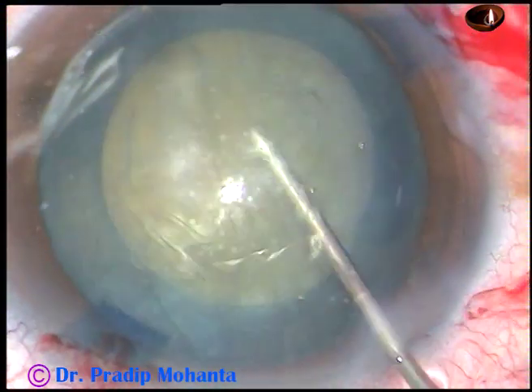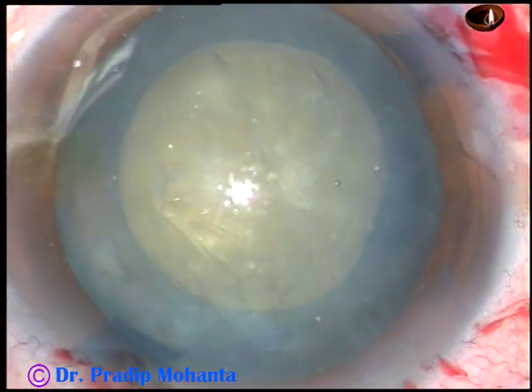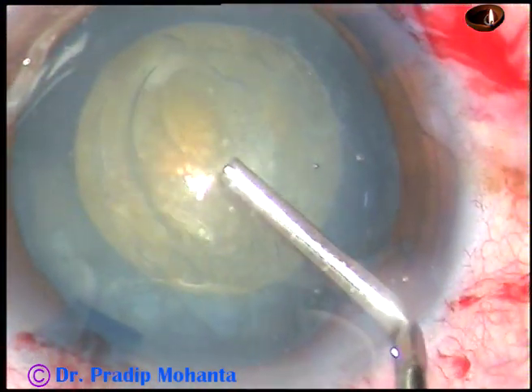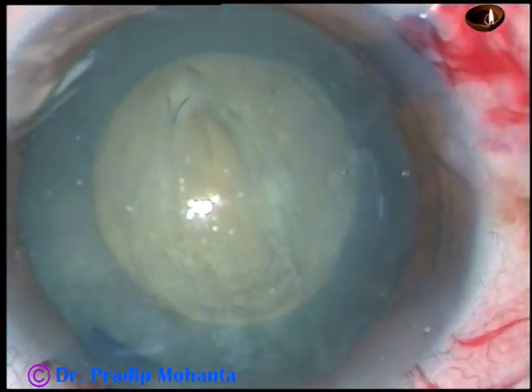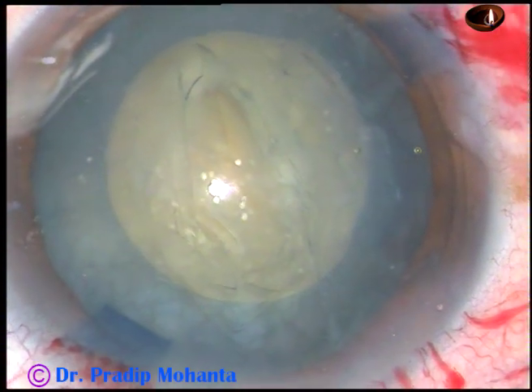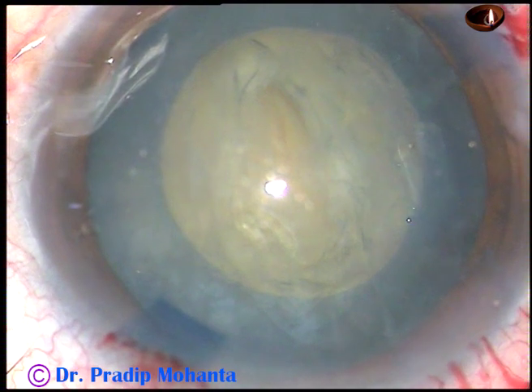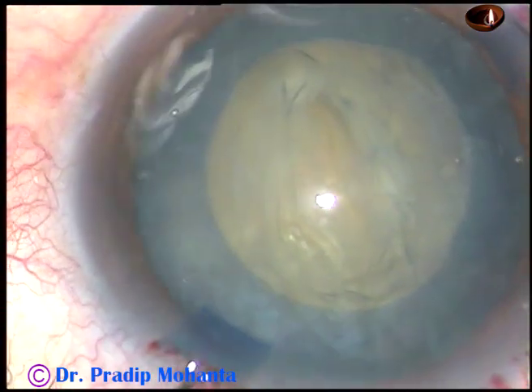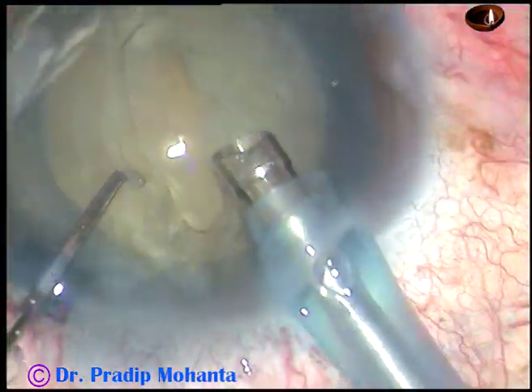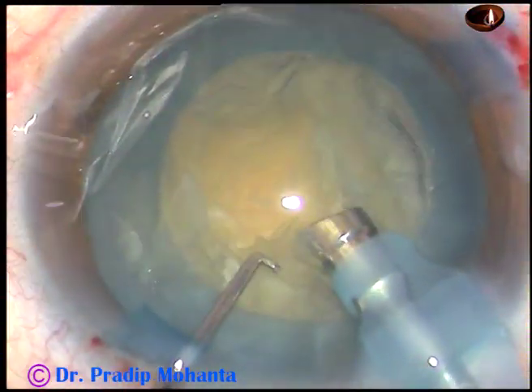Now hydrodissection is done and the nucleus is rotated. Visco is injected again and now is the time to introduce the tip of the phaco handpiece. The machine being used is Oertli Catarix 3 from Switzerland. The tip of the phaco needle is introduced into the anterior chamber with bevel up, keeping the bevel sideways.